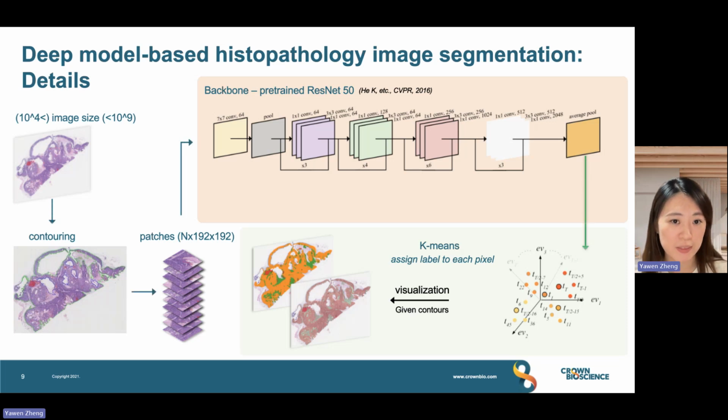We want our platform to focus on the tumor area instead of the background. So we use machine learning based algorithms to get the areas that we are really interested in. For example, the areas between the green and the blue lines are the parts that we need.